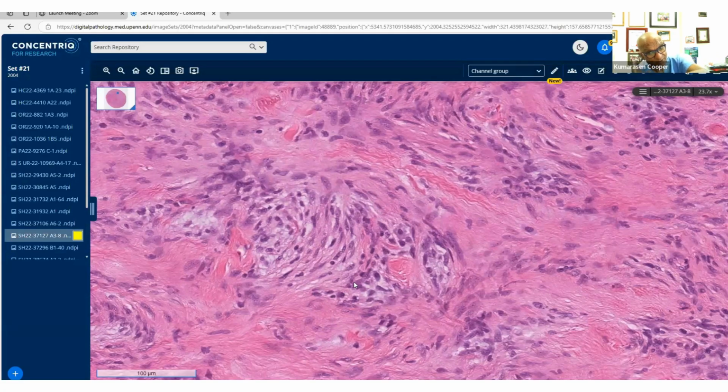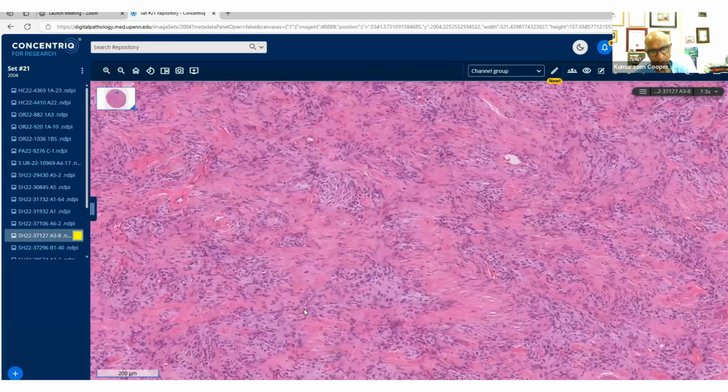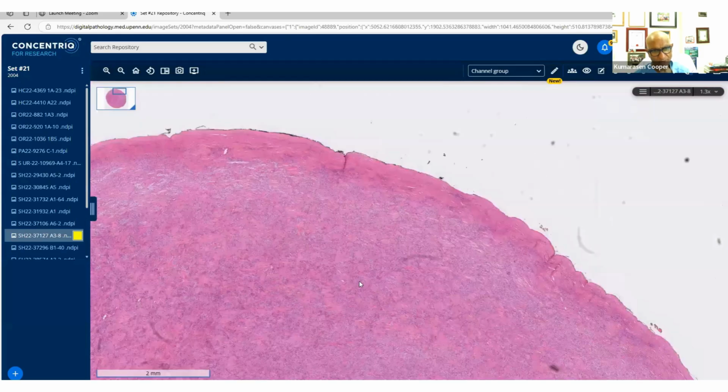Now, if you're thinking perineurioma, then always ask yourself, well, could this be a hybrid tumor? And we, when I say we, my fellow Ahmed Lazim was finishing up with us this week. We always do all three markers for neurofibroma, schwannoma, as well as perineurioma, because sometimes you pick up these hybrid tumors where you have mixed neurofibroma and perineurioma, or mixed schwannoma and neurofibroma, or mixed schwannoma and perineurioma. So keep that in mind.